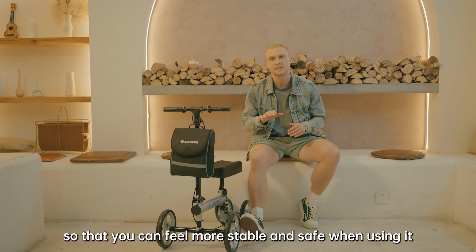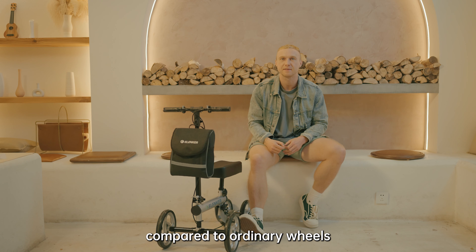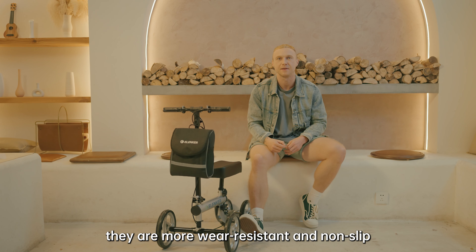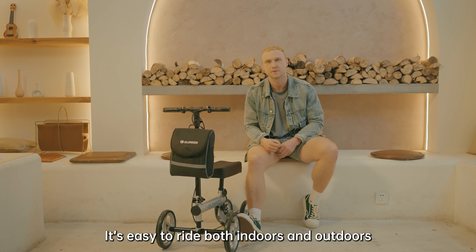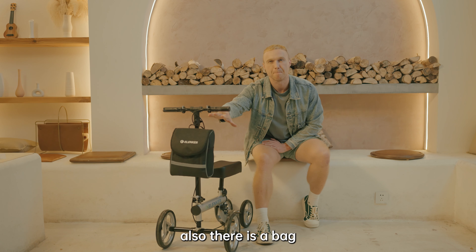Our wheels have a special texture compared to ordinary wheels — they are more wear-resistant and non-slip. It's easy to ride both indoors and outdoors. Also, there is a bag which helps me to carry my stuff.